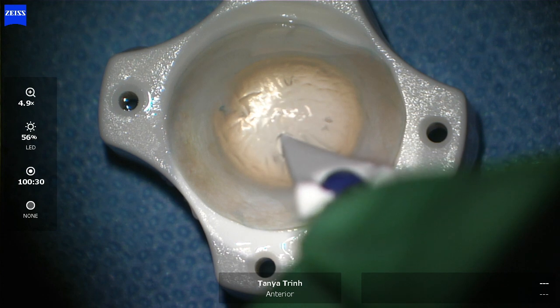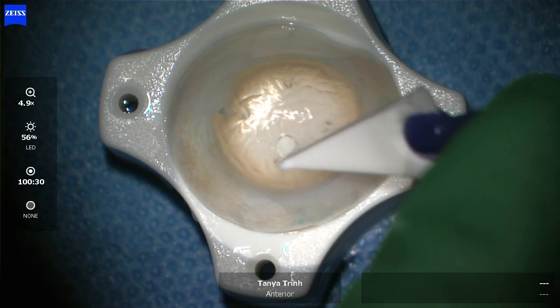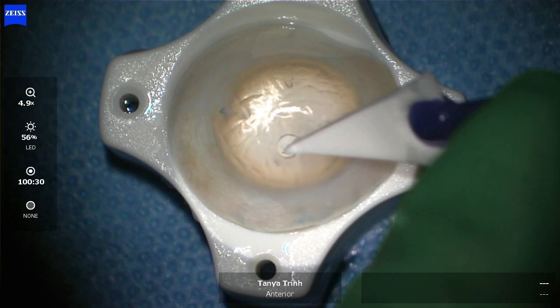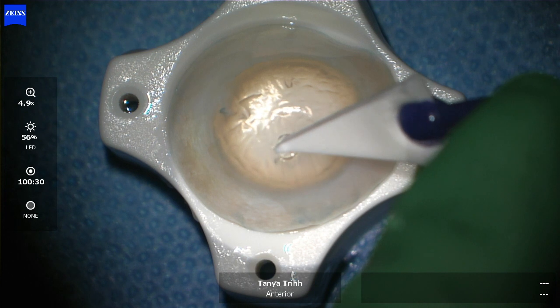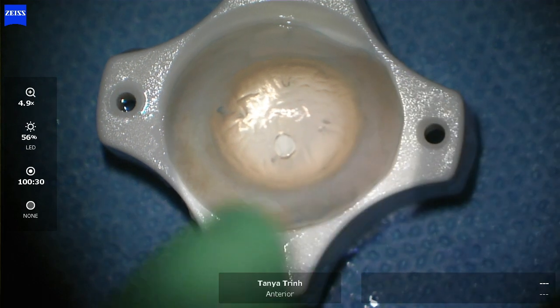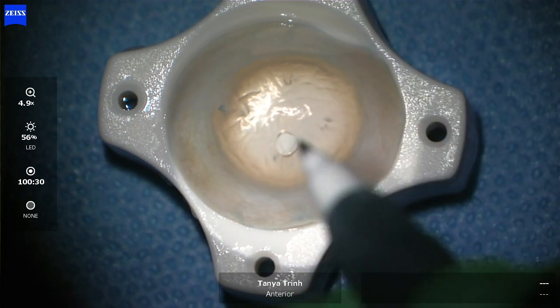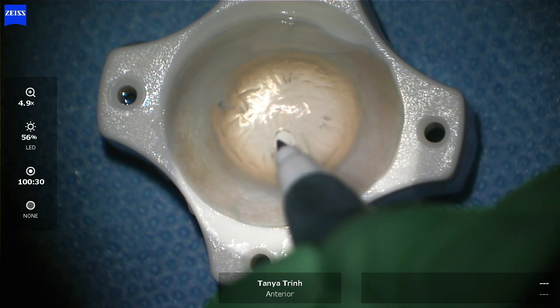The worst thing you can do is to hasten this step — if fluid leaks in whilst you're trying to make your stamp or ink, that ink will spread and will make things quite challenging. It is possible to pop the membrane, so you do need to be a little bit careful at that step.